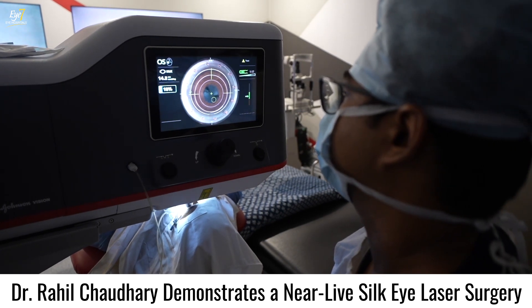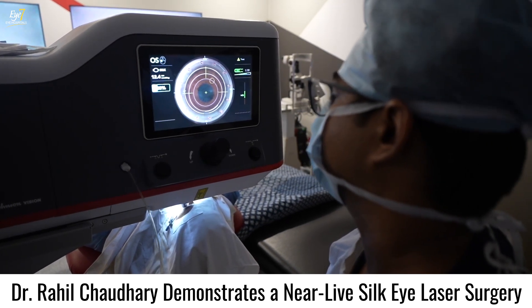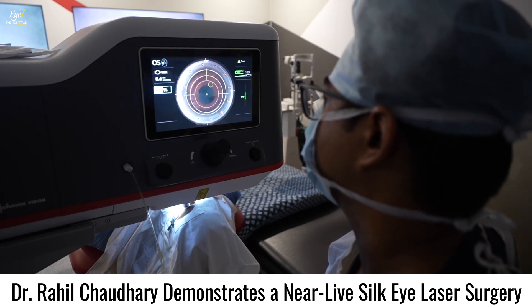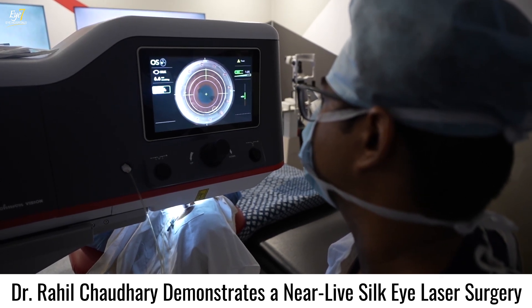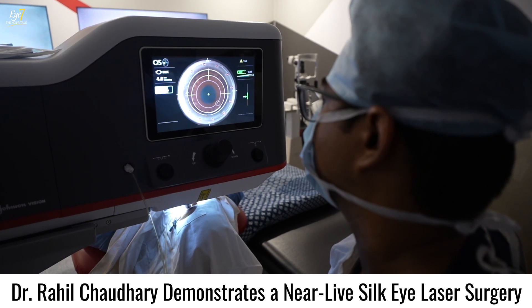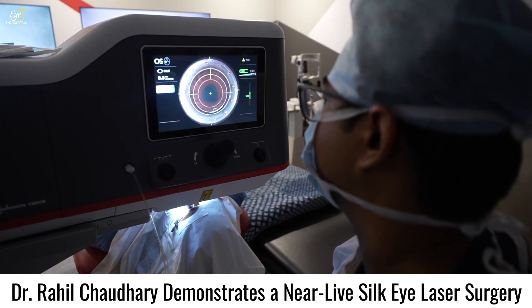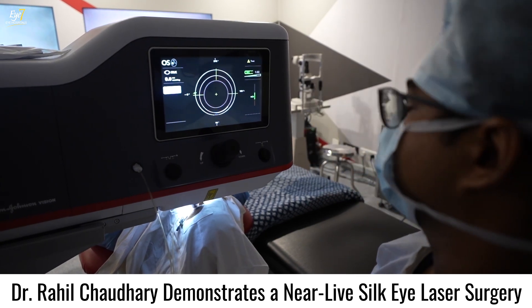The laser has started. First it makes the posterior plane, then it makes the ring cut, and now it is making the anterior plane — nice and smooth — and then it makes the entry cut. That's it. 17 seconds. Nice and done.